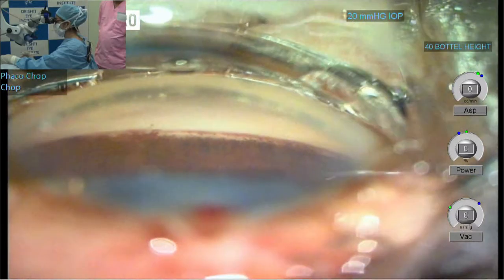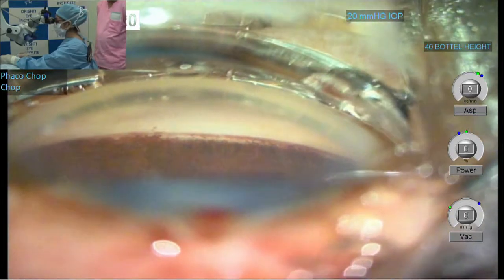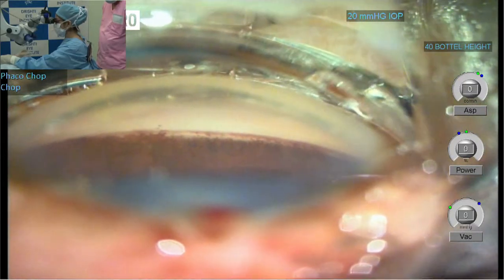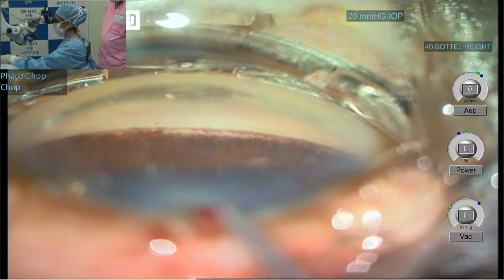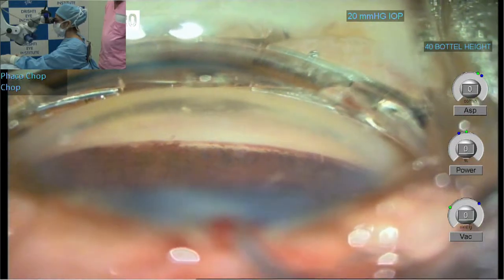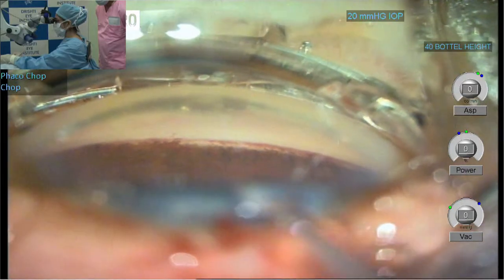Anyway, okay, now I have this injector in my hand. It's too zoomed for me to show it right now. Right now I'm going to start with demonstrating just the implantation. We can talk about the ergonomics a little later. So there is an insertion sleeve which needs to be closed before insertion. And I've already made my 2.2 incision, which is temporal. I'm sitting temporally to the patient. There is a cohesive viscoelastic which has already been injected into the eye.